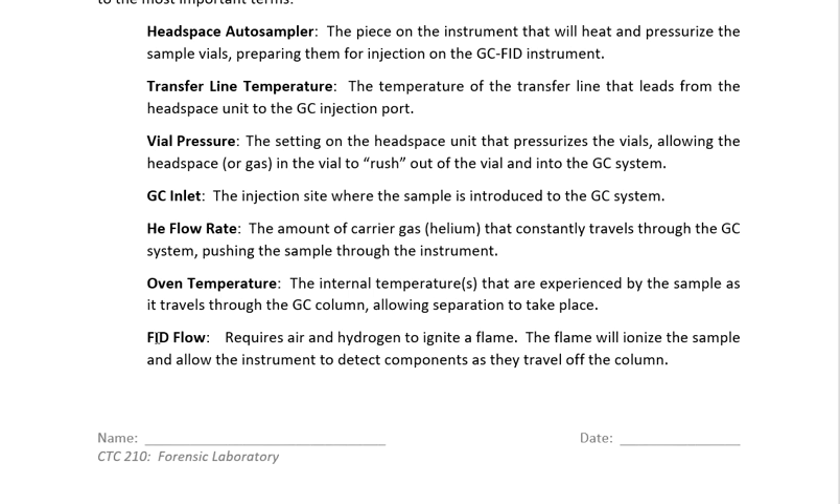Finally, we have the FID flow. The FID, to work properly, requires both air and hydrogen. Hydrogen comes into the system and is used to ignite a flame. This flame analyzes the components coming off the GC system so they can be detected. It looks for ions — charged pieces that are being created — and because they're charged, they're easier to detect and show up on the computer screen as positive signals.